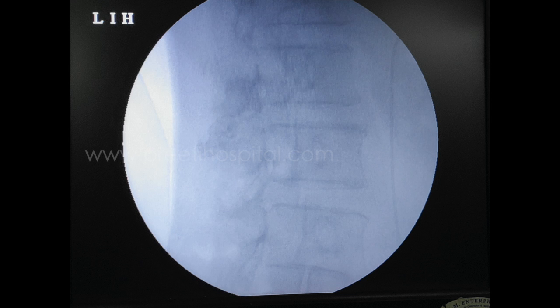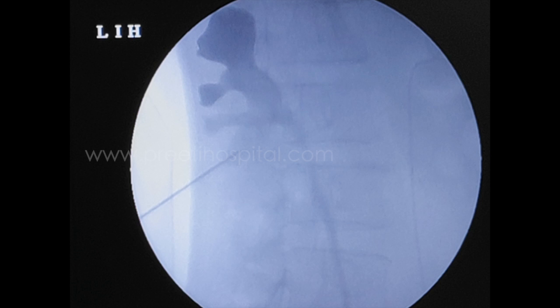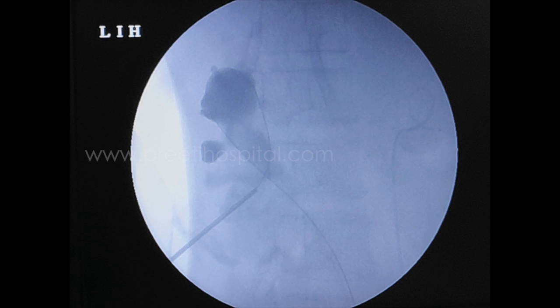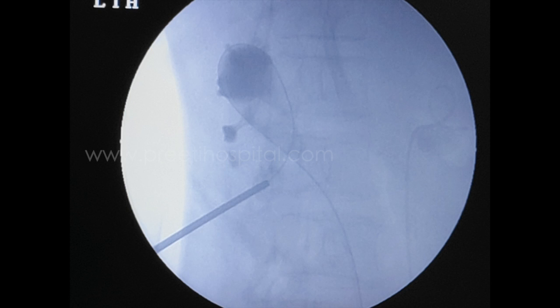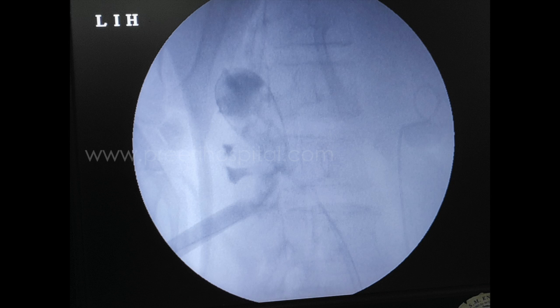Naturally, the inferior calyceal puncture is preferred. The advantage is you can hit the stone and pass the guide wire like this. Once you do dilatation, whether in prone or supine, you will finish the inferior calyx. After that, negotiation to the pelvis and upper calyx is easier with the supine PCNL is our observation. That's what we wanted to show.